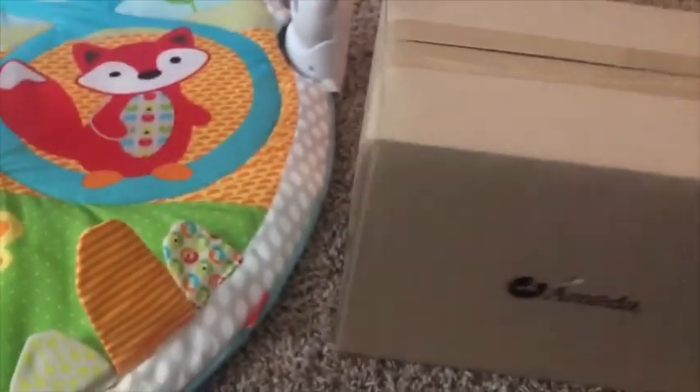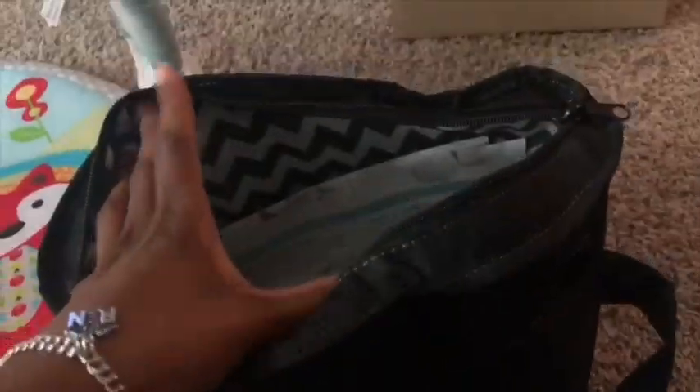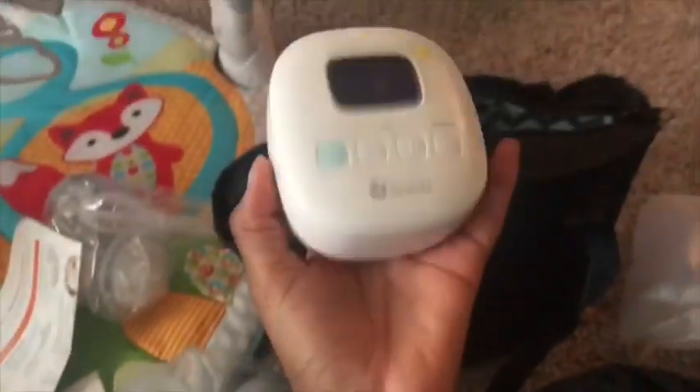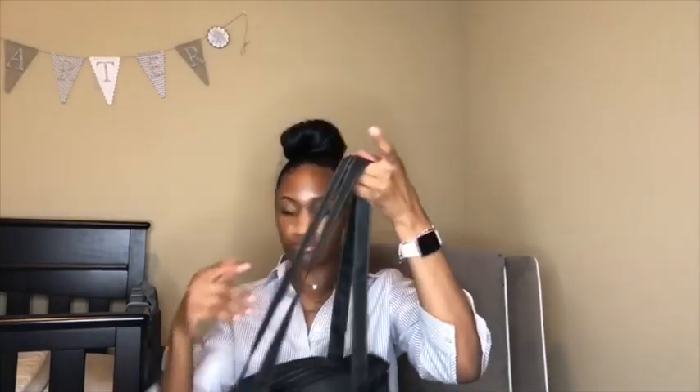I have an unboxing video that I'll try to put in — this is me unboxing my new Mya pump. It comes in this small bag, and one thing I love about Ameda is they always send a bag with their pump, which is phenomenal — I mean, what am I going to carry it in when I go to work? This is the bottle it comes with.